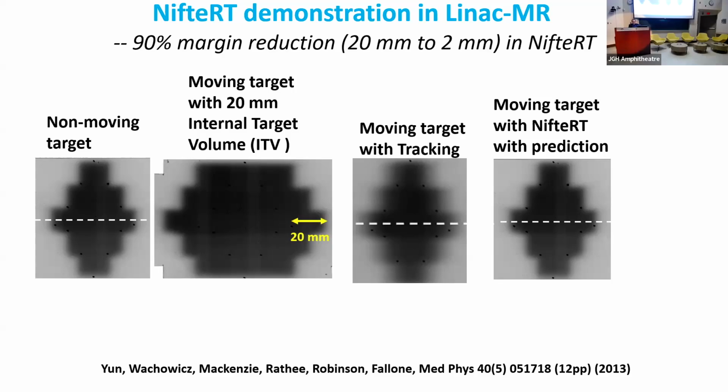And now we've used prediction. Add prediction to that, and that's different for every single patient. We looked at, for example, 40 patients with breathing problems. They're all completely different. So you've got to know each patient's pattern, and we know that from the MR simulation process, which we do anyway. Each patient breathes that way, so that goes into the algorithm. When you treat the patient, that training is only for patient A. Another patient comes in, it's a different training through MR Sim. Patient B, etc., and they go on this way. But because of that, we're able to be really accurate and precise in following the tumor.